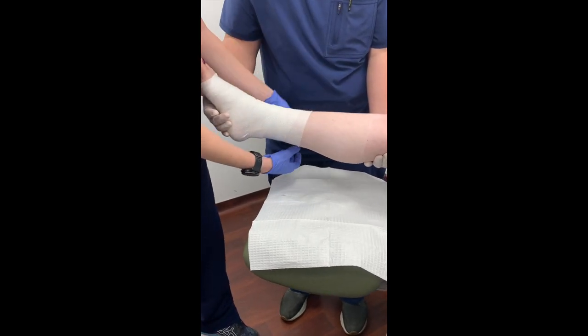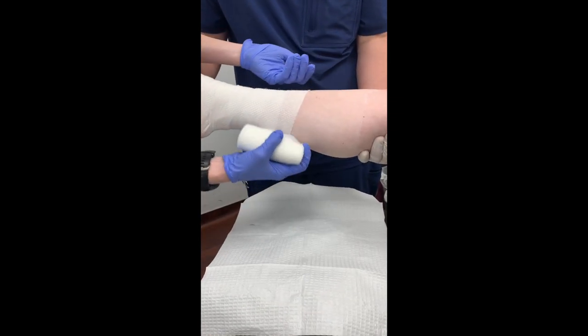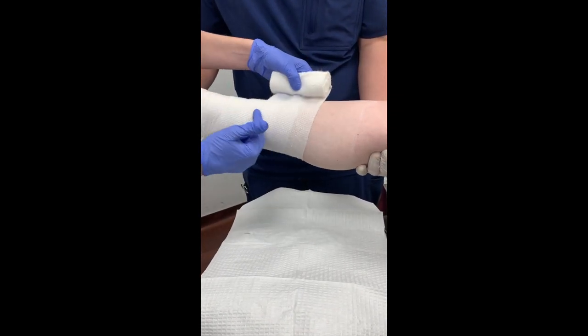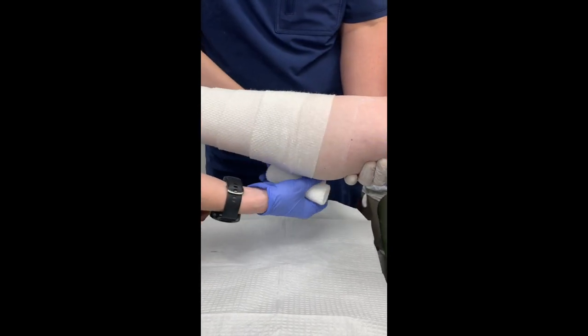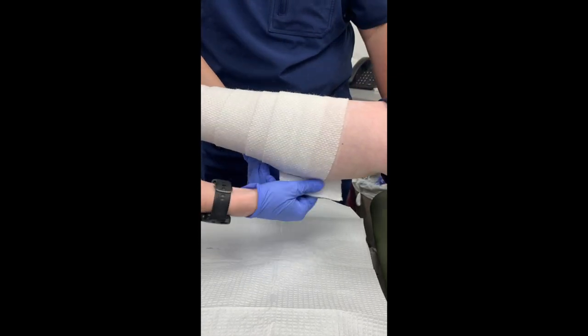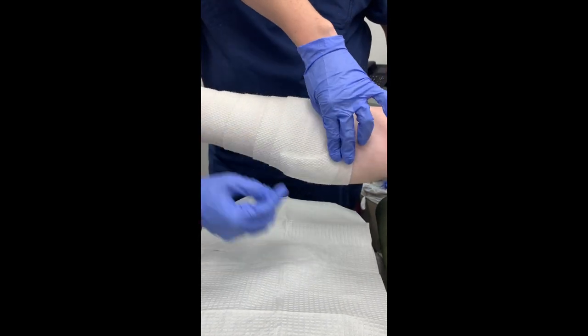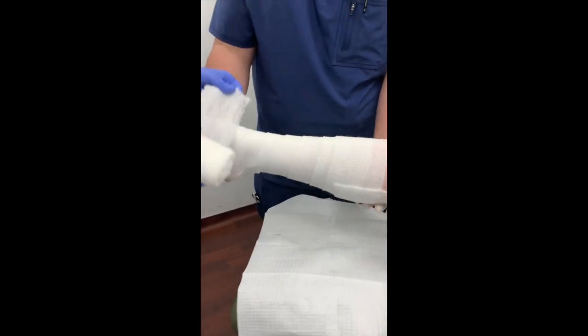You can put some compression through this layer, but the cast padding material is not going to provide a lot. The biggest thing is 50% coverage across every layer of the dressing. You could do the herringbone technique — that's the around-and-up, around-and-down technique — depending on the amount of compression you want. Then move on to your next layer: Curlex.